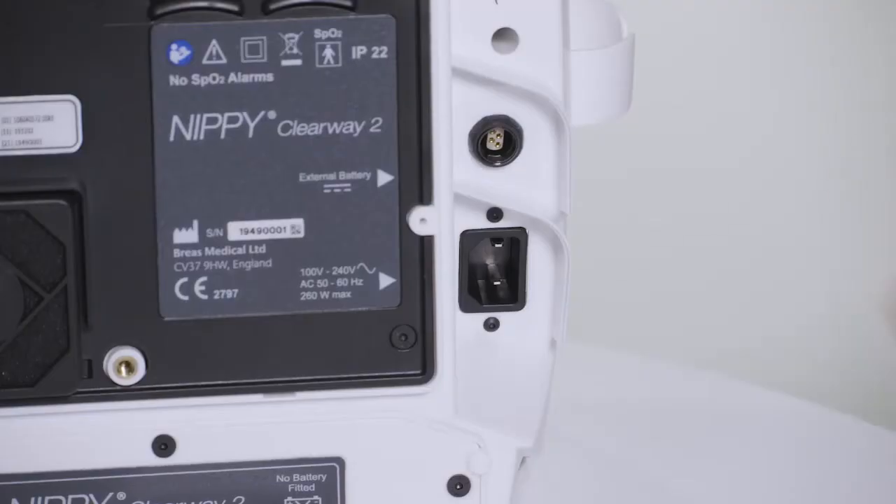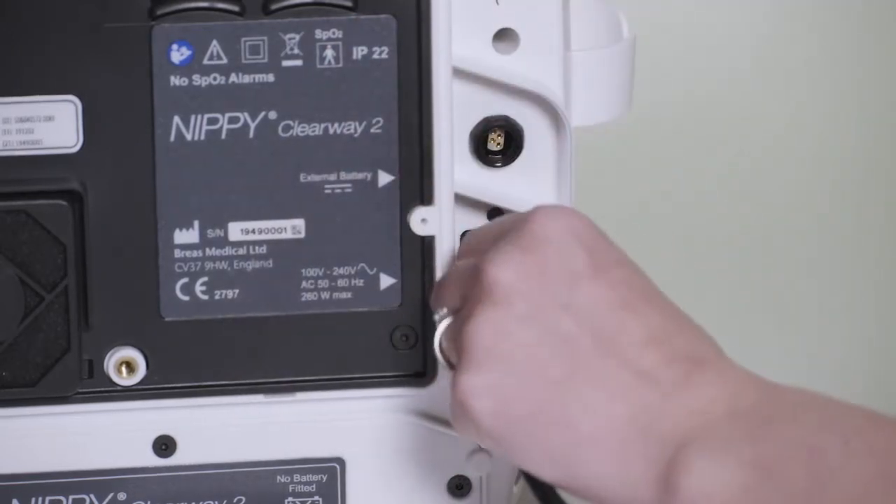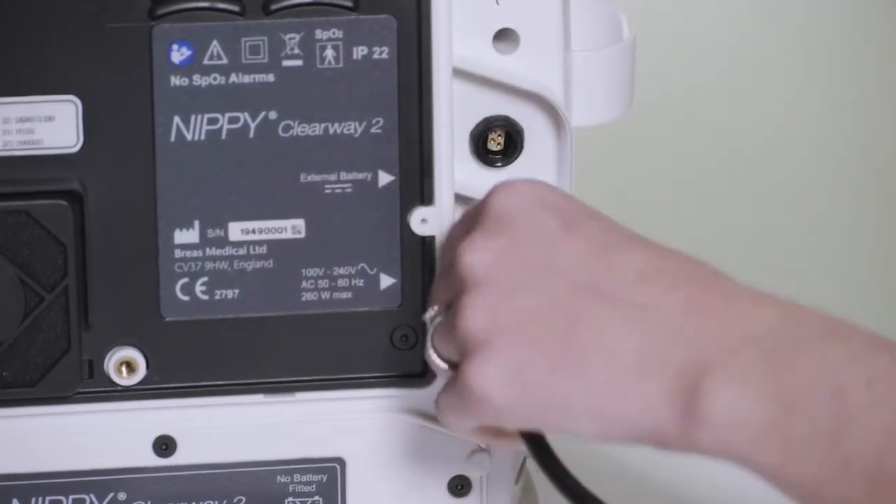Connect the mains power cable at the rear of the device, then connect it to the mains power socket and switch the power on.